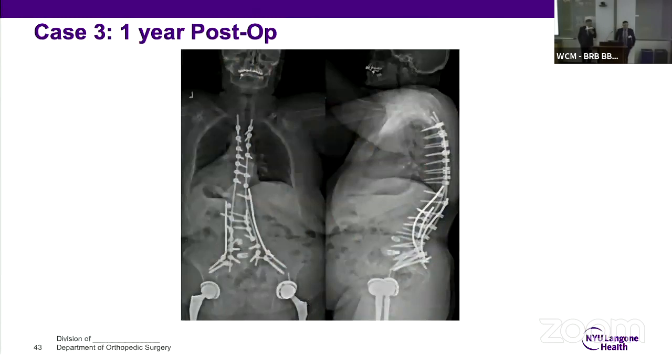Maybe a question that goes in a similar direction, but I have a really hard time imagining that, especially if you have those severe deformity cases, that you can match a preoperative CT with intraoperative X-rays really accurately. I mean, we use intraoperative CT scan and we go through all types of hoops to make sure there's no movement, and even then sometimes it's not 100%. How can you match those anatomies? That seems hard. You have to use 3D.